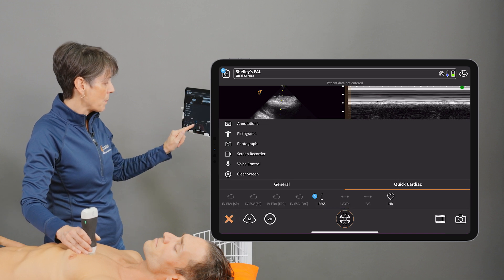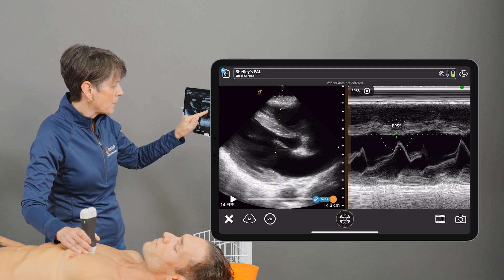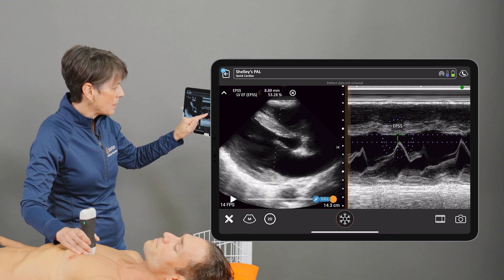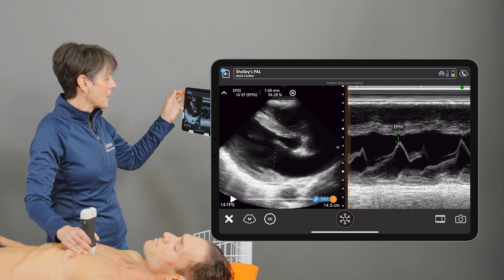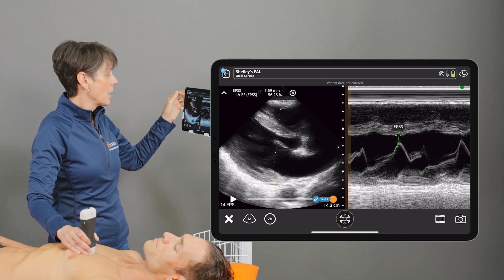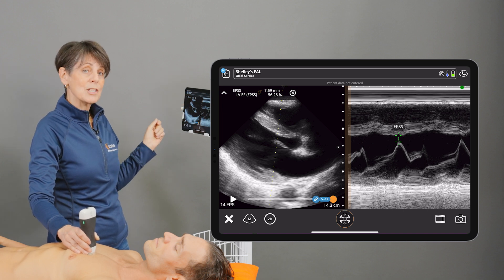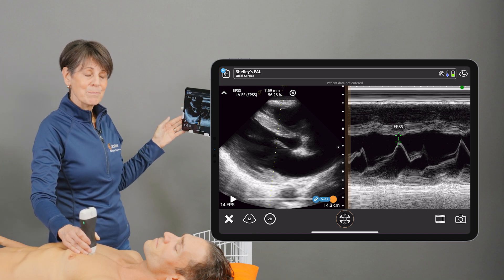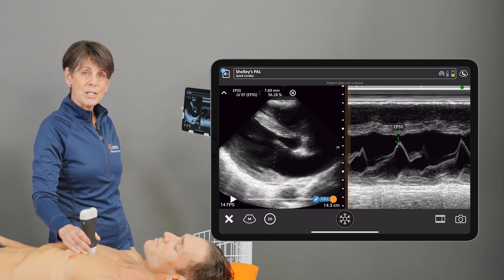Then I'm going to go into the measurement package and measure the EPSS — from the septum to the highest point on the E-point of the mitral leaflet — and we get a number of seven and a half millimeters. The app also calculates an ejection fraction from that, so we're getting an ejection fraction of 56%. There you have it: a nice quantifiable way to get a quick left ventricular ejection fraction.